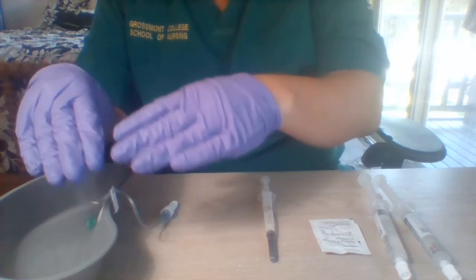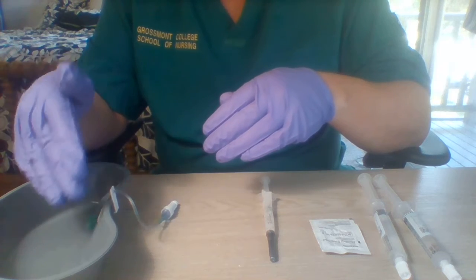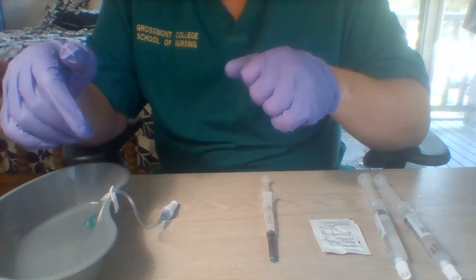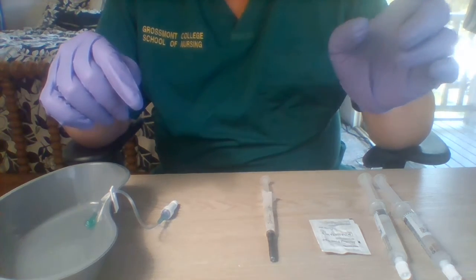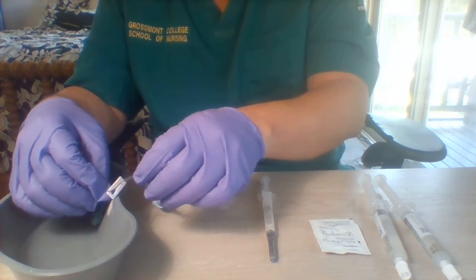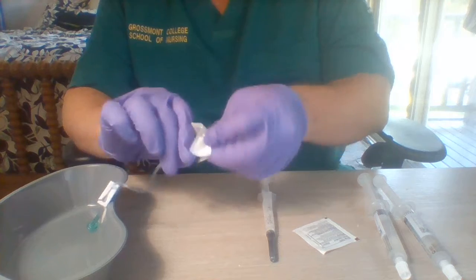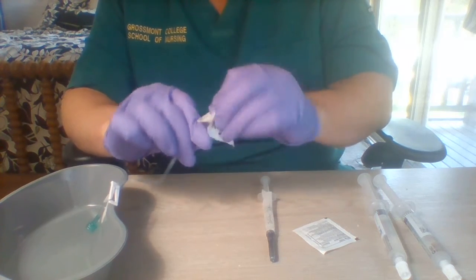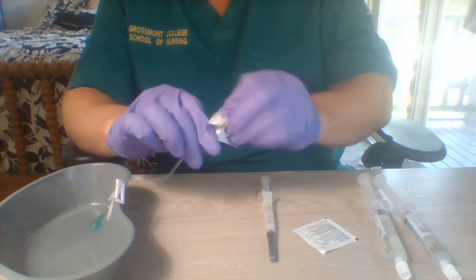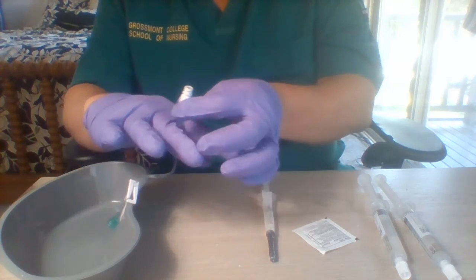And first, I want to assess the patient's IV site, checking for inflammation and infiltration, any redness or swelling or warmth coming from the IV site. I need to stop the infusion, pinch the IV site, and clean the port with an alcohol swab, cleaning this vigorously for 20 seconds. And I'm choosing the port closest to the patient. So I hold on to that.